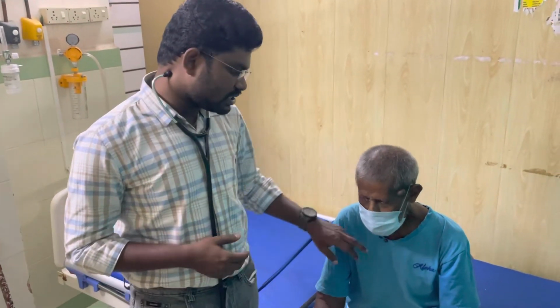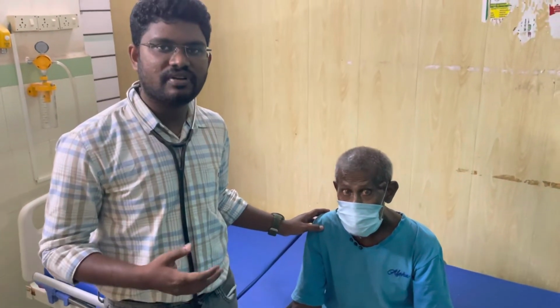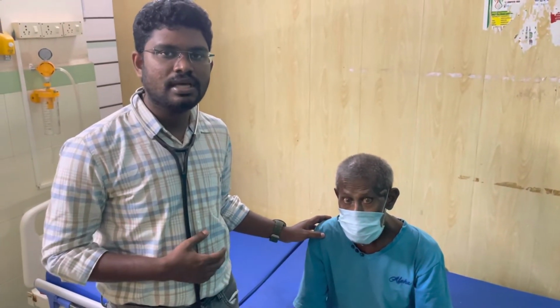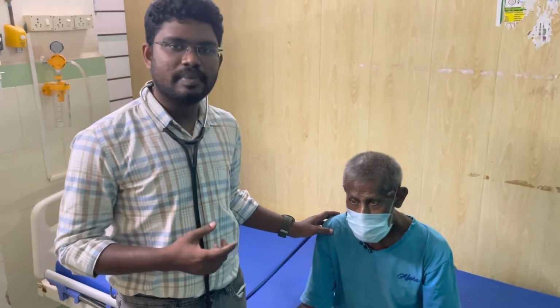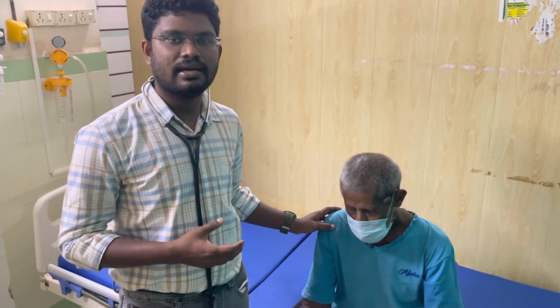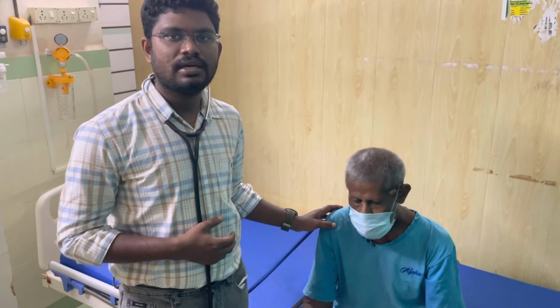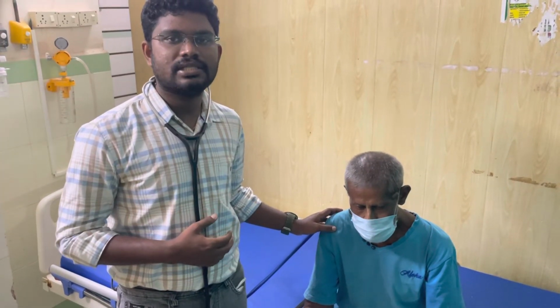So first we heard the murmur at the right second intercostal space with the patient leaning forwards and during expiration. Then the high-pitched component we heard at the apex, an ejection systolic murmur conducted to the apex of the heart, and it is not radiated to the axilla, so we differentiated it from the mitral regurgitation murmur.